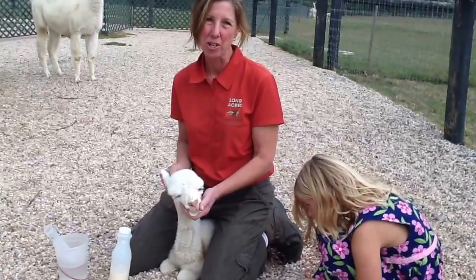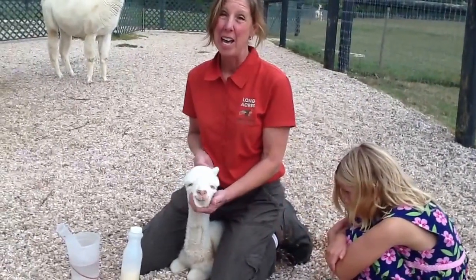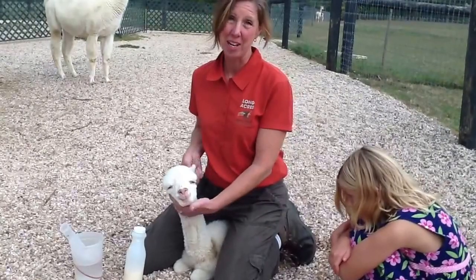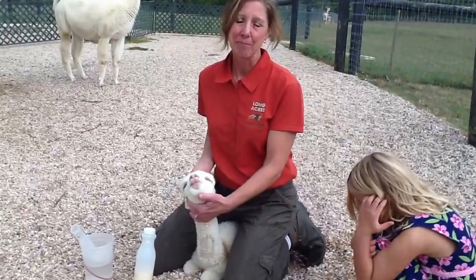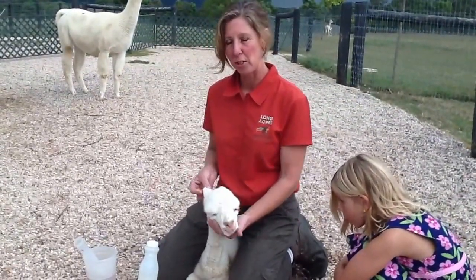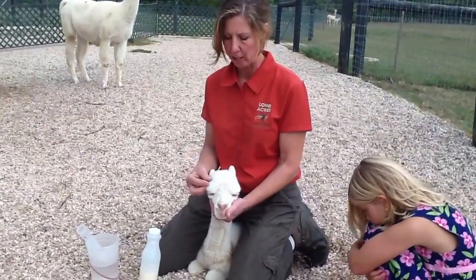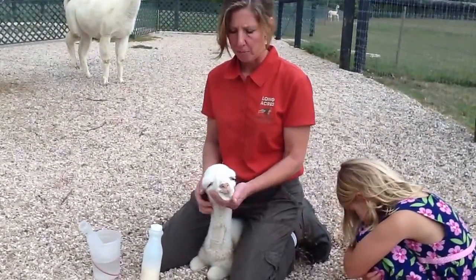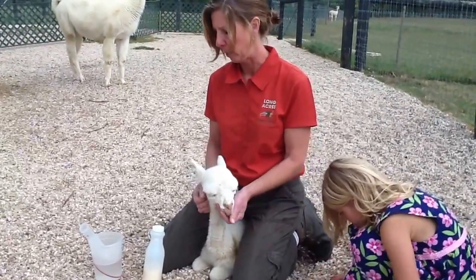It's not the best situation because we know that the feeding tube puts the milk in C1, and we'd really rather they suckle so that we shoot the milk down into C2 or C3. But it's the best we can do. We try not to overload them with too much volume so that it doesn't just sit there in C1 and go bad. But at least until he can get going on his own a little bit better, we're going to put the feeding tube in.